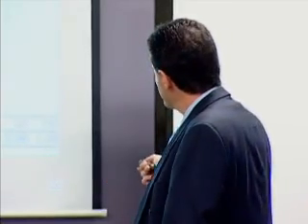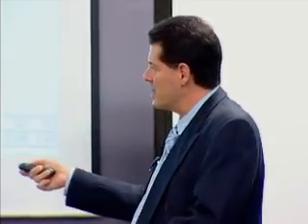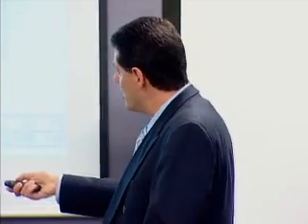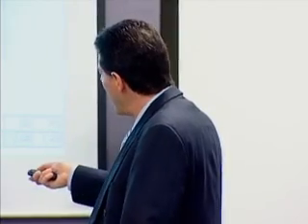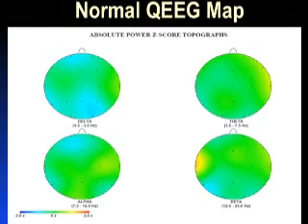Each of these boxes is one of the 19 electrodes, and this is a theta to beta, a daydreaming to attention ratio. It should be between, for a young child, 1 and 4. For an adult, 1 and 2. These were right where they should be, 1.4, 0.9, 1.8. This is good. The daydreaming and attention were about the same. That's what you want. And this is what this child's brain map looked like.